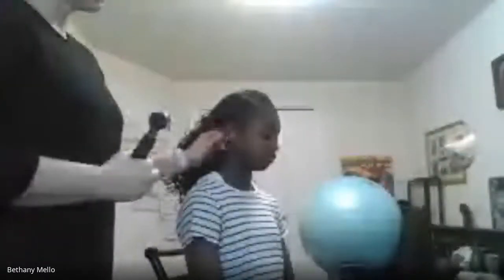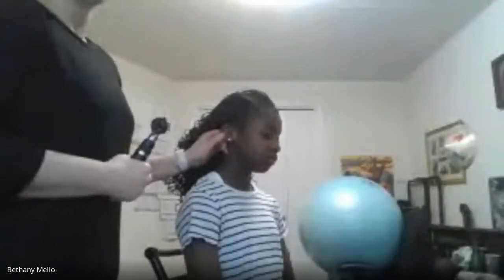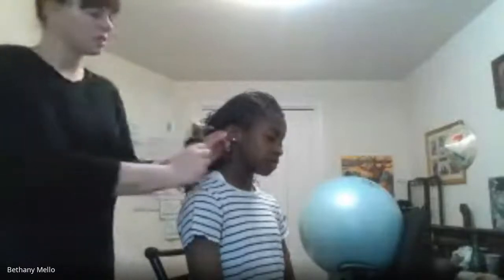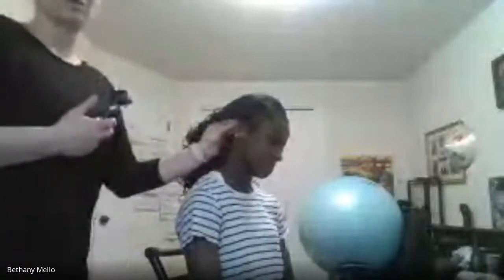So I said back and down, but down and back. So as you're inserting the otoscope, you're going to take note of the external canal, and you're going to look for any discharge, scaling, excessive redness, lesions, foreign bodies, cerumen. So since she's not 3, we're not going to do this. We're going to pull up and back here. Okay. Now when I'm saying support the head is what you can do. There's a couple of different things.